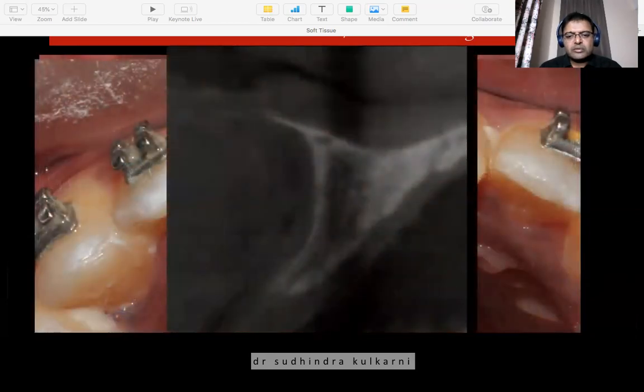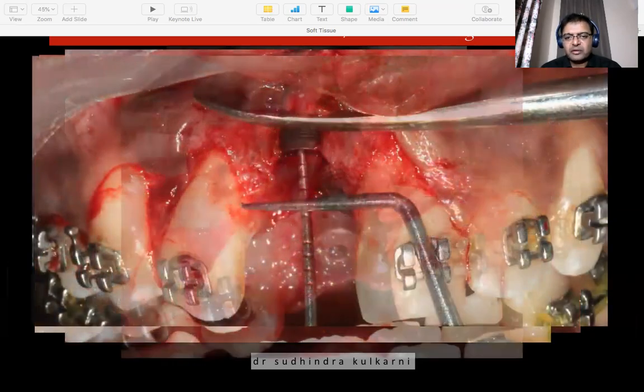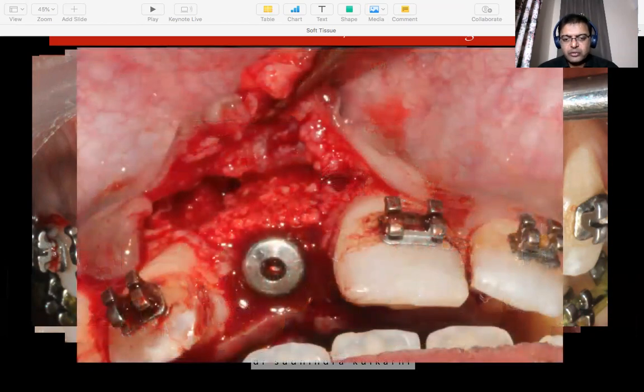Yeah, that's how the bone was prior to implant placement. It was adequate enough to get the implant in. So we did the implant. Some threads were exposed, so some bone graft along with that. You will always see that the implant goes in ideal 3D location: apicocoronal, mesiodistal, buccolingual. All the exposed threads were first covered with autogenous bone.